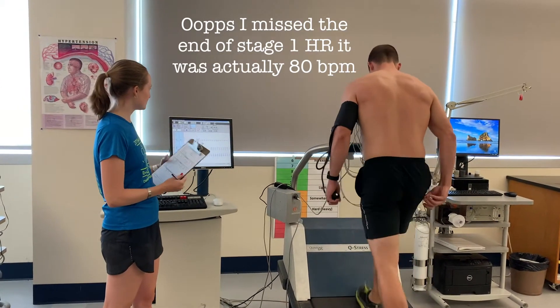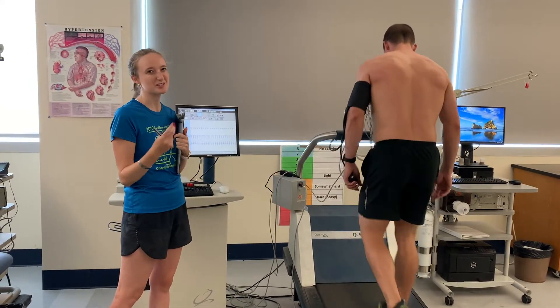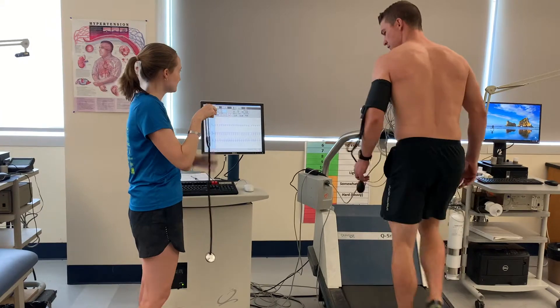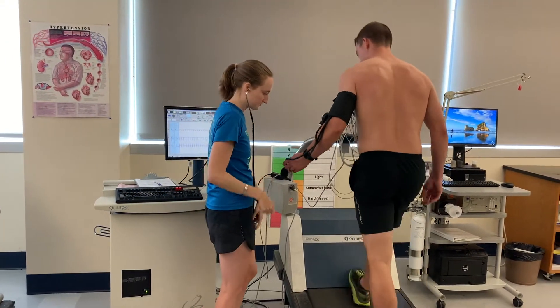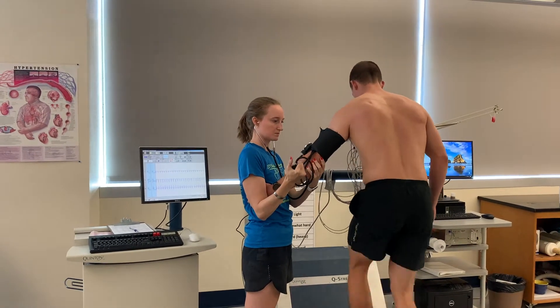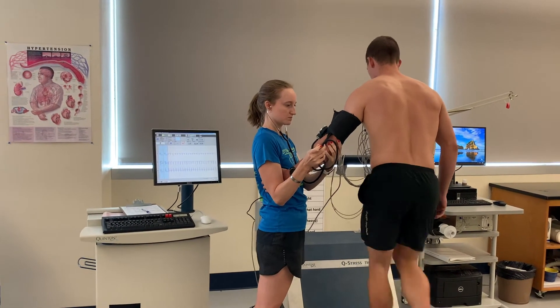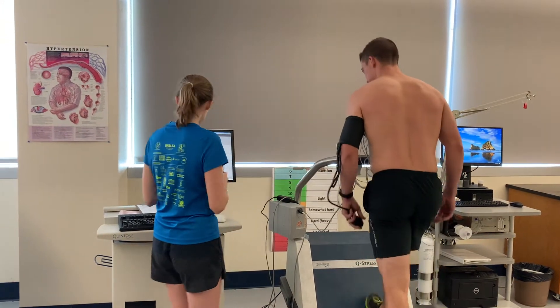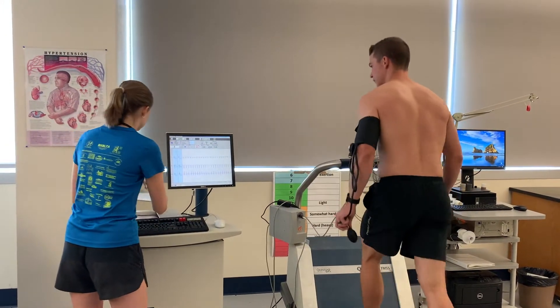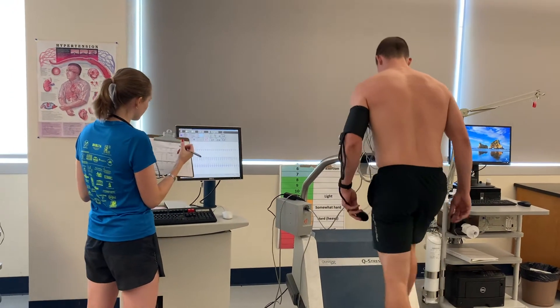We've started stage two. Because the treadmill went up right after I was done with blood pressure, I'm going to start taking blood pressure at the next stage a little bit earlier. We are at two minutes into stage two, so I'm going to go ahead and take the blood pressure. Got 158 over 82, and his heart rate is 98.